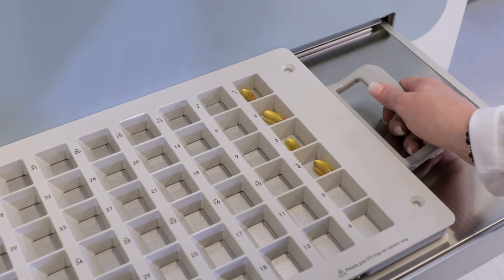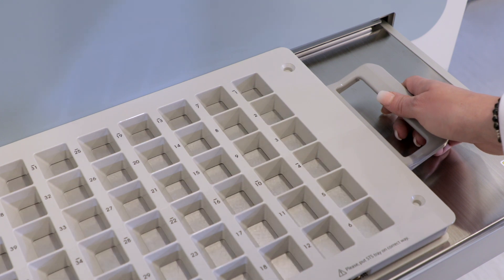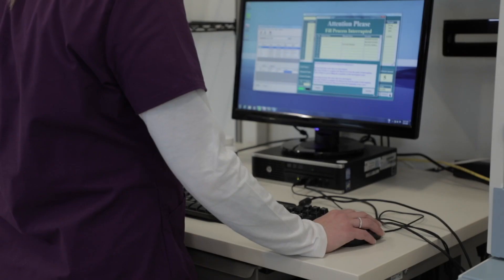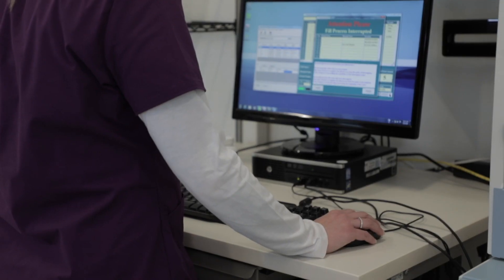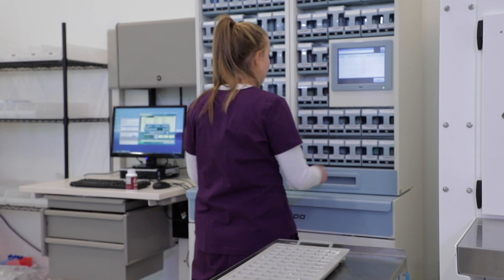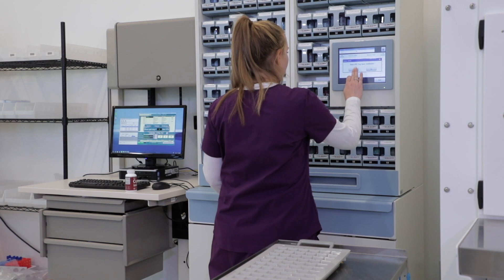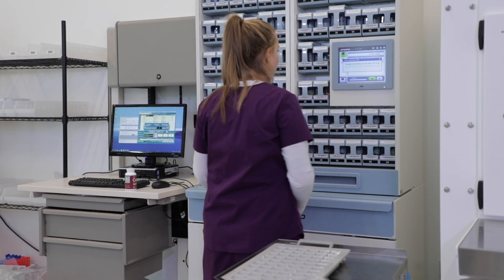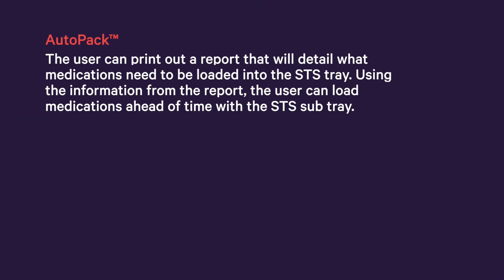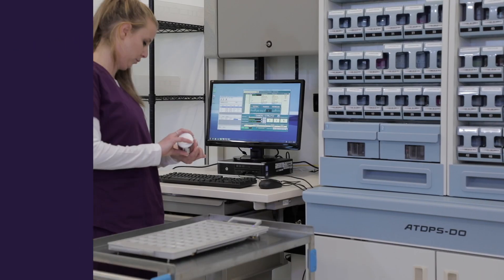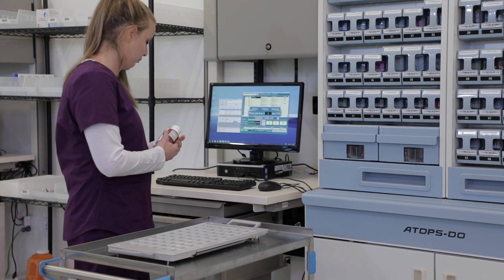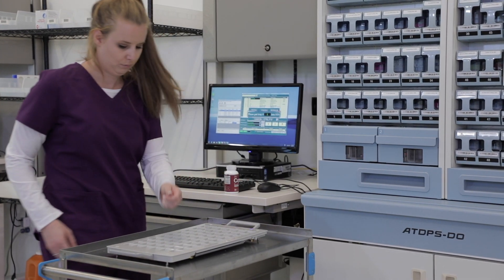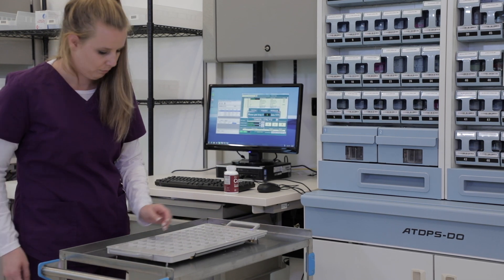Pharmacies can also use multiple STS sub-trays to fit their specific pharmacy workflow. After an order is received that will utilize the STS tray, the pharmacy user selects Fill and starts the packaging process. The user can print out a report that will detail what medications need to be loaded into the STS tray. Using the information from the report, the user can load medications ahead of time with the STS sub-tray. Once the sub-tray is filled with the required medications, the user follows the packaging process to utilize the STS tray.